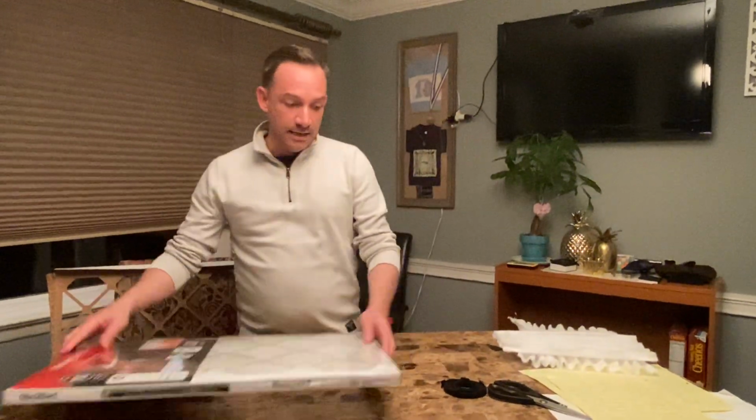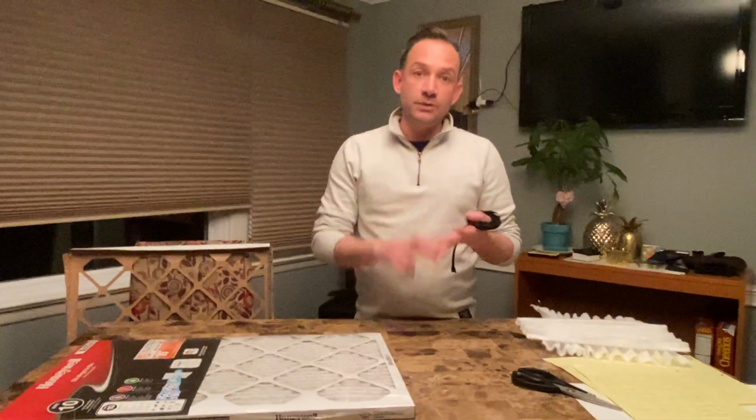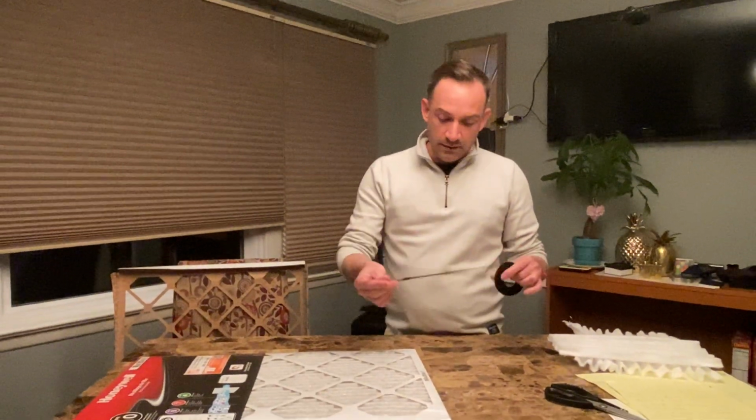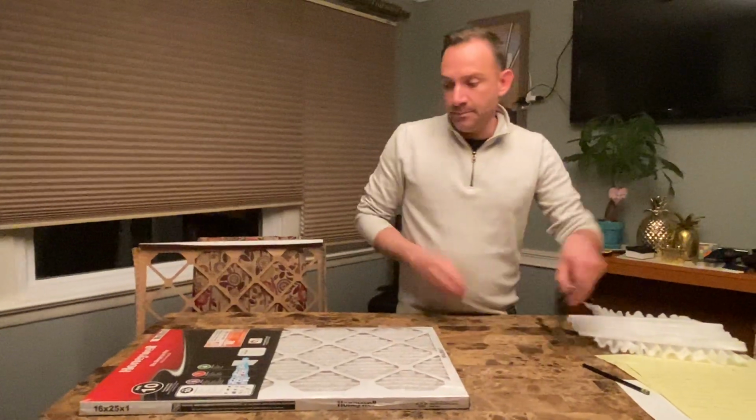You can get any size. You can get a Velcro, rubber band. You can use ribbons, shoelace, anything that comes to your mind. You're gonna need a scissor, and that's it.